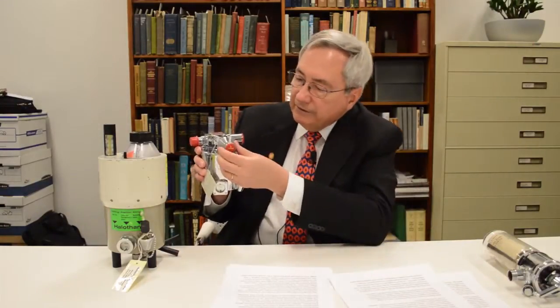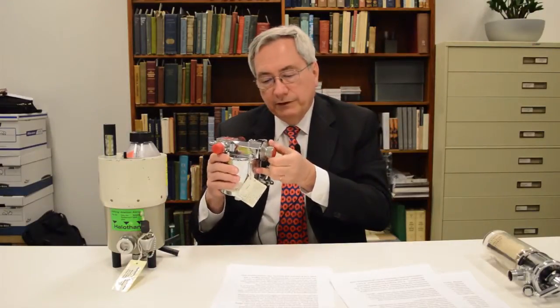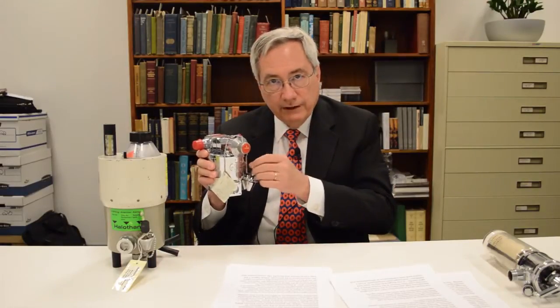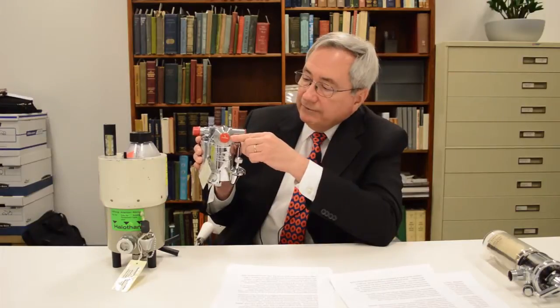It is a definitive on or off, so you have to pull it out before you can rotate it to begin delivering the anesthetic to the patient. And once it's popped in, it doesn't deliver anymore. So that's a safety device that you can look at clearly to see if you're delivering some or none.